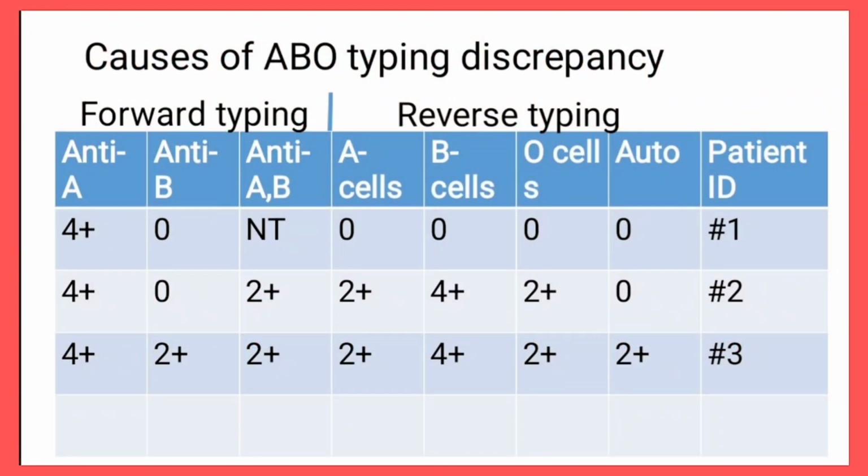So like I did mention, the person had shown us this. I have done the first part, which is patient one. I'd already finished that. So we're going to look at patient two. Just as a quick recap, when it comes to ABO discrepancy, simply put, anytime the forward did not agree with the reverse, or the reverse did not agree with the forward, that is ABO discrepancy.